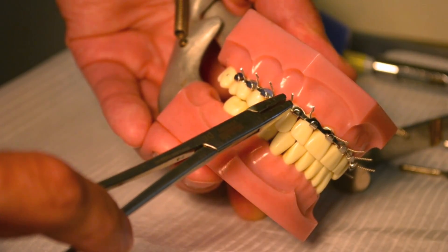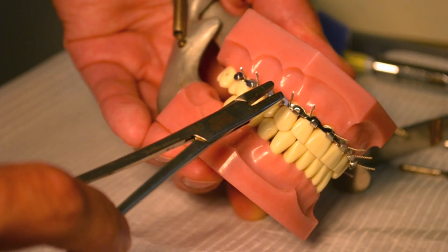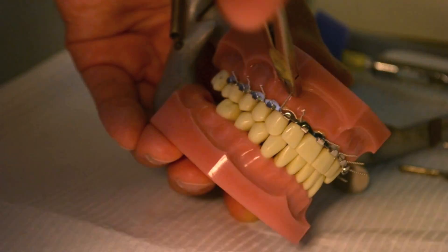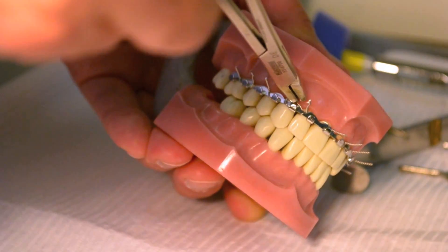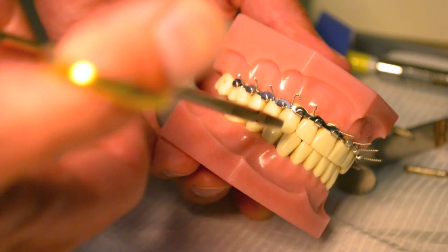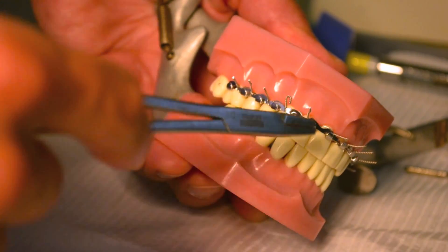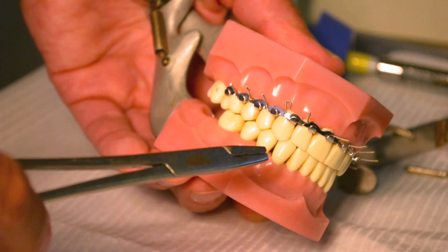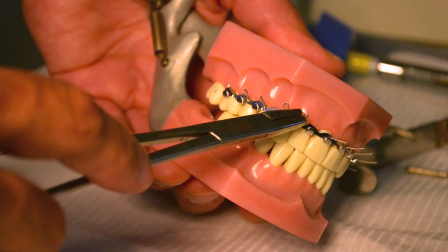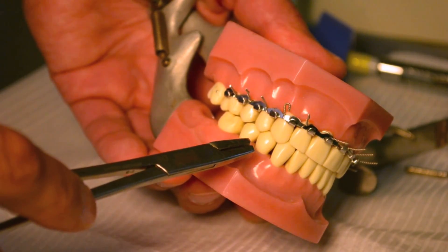Once you've cut the wire short, it's time to place your final twist into the wire and lay it along the gingiva. I do this by grabbing the wire at a 90-degree angle with a needle holder, pushing the wire directly against the gingiva, and giving it a hard clockwise turn as you're pushing it against the gingiva. After giving the wire that twist, simply take your wire twister, grab it, squeeze the wire, and adapt it as best you can against the gingiva. Take care not to place these hooked sections of wire into the lug areas themselves, as that might make it more difficult to place your inter-arch fixation at a later point.